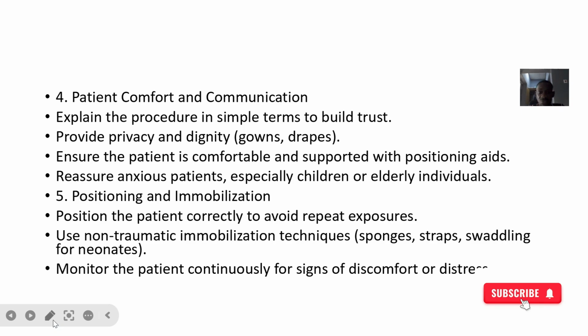Patient comfort and communication, you're just ensuring that the patient is comfortable throughout the procedure. You're trying to calm down the situation if a patient is anxious. So position and immobilization, you're trying to position the patient correctly and make sure that during the time of imaging the patient doesn't move, so that you get crystal clear images, so that there's no need for you to image the patient all over again.